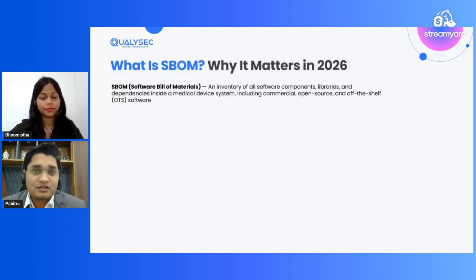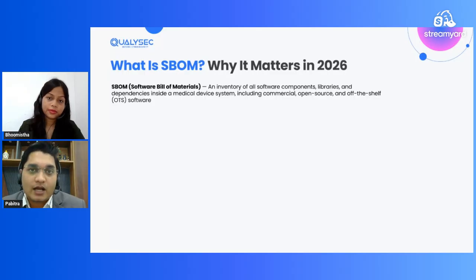So we'll start with, okay, what is SBOM? You can think of it like this: there are multiple components you are using to build your medical device, multiple software components. To analyze those, which commercial vendors you are using, how many open source components you are using, those things are listed in one place. That is called an SBOM. With my experience, for the past 3 years, we have been doing FDA submissions for different clients.